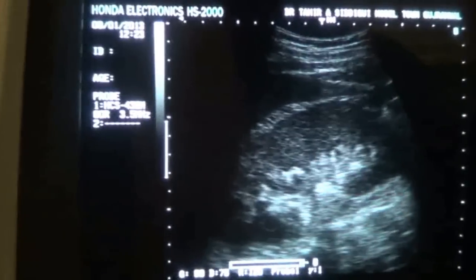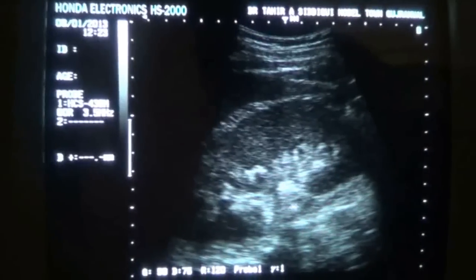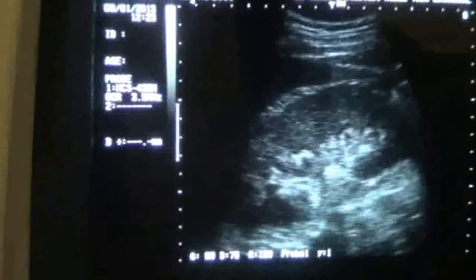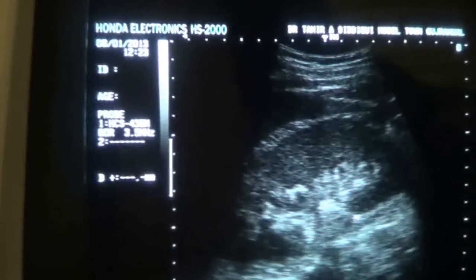Now this is the proximal ureter, this area. The proximal ureter is not dilated.